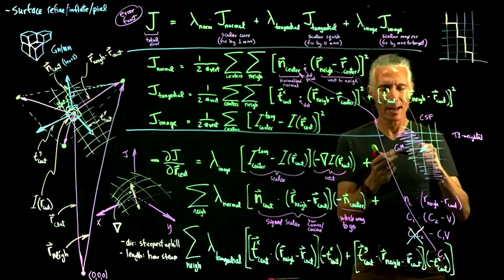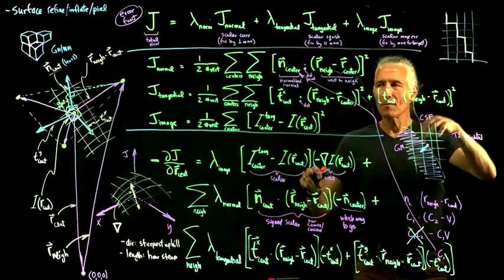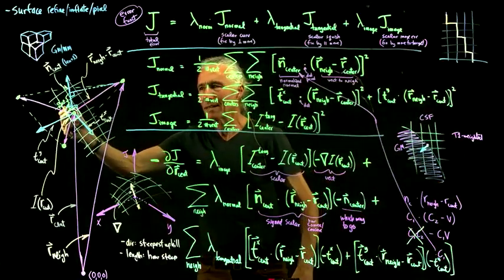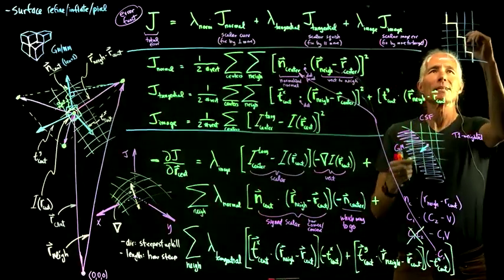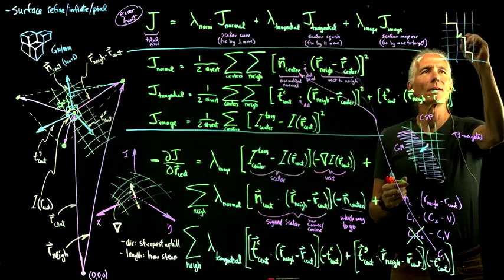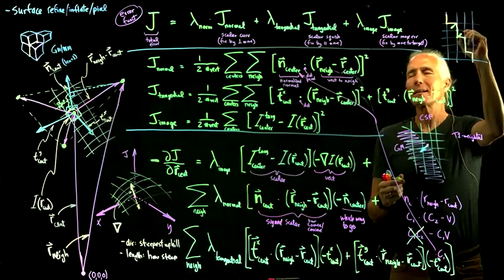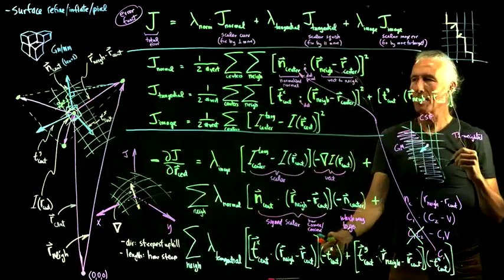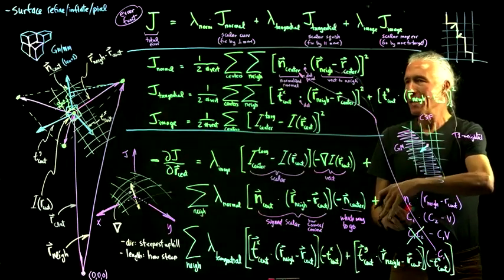And so if we want to make a subvoxel estimate of the gray matter, we run this whole thing with our original data that we made the blocky surface from in there. And then what that will do is that, like in this case, this guy is very concave. And so what direction is this guy going to go? It's going to have to go out there. And this guy's also concave. It's going to have to go out here. This guy is flat, so that guy won't move initially, but it might be moved by some of these other terms that are trying to redistribute the vertices around to retain their original area, basically.